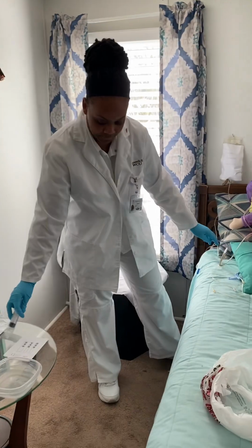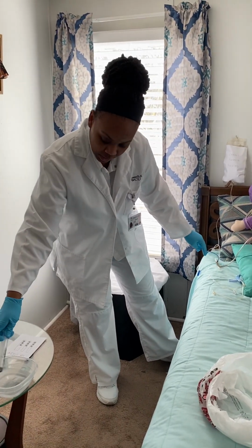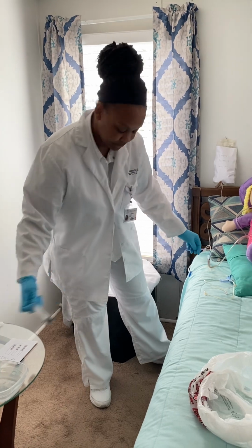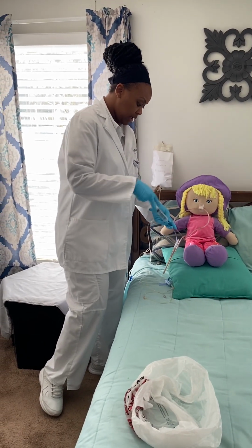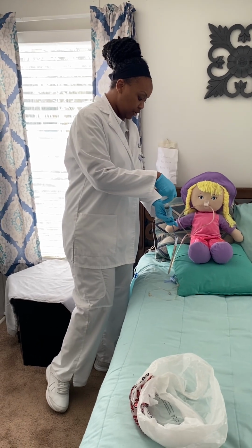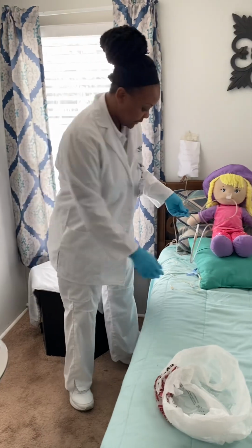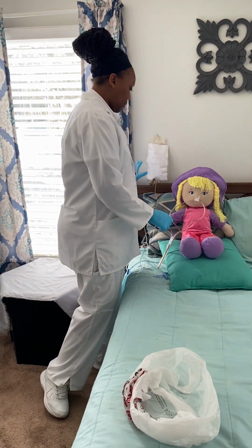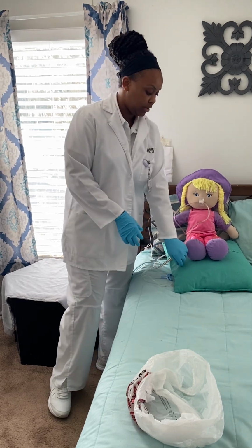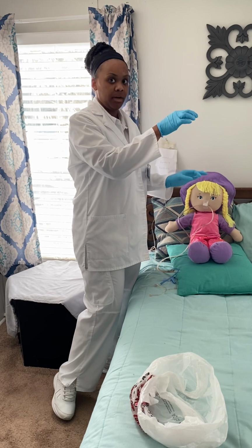So I checked that. And at this point, I would go ahead and pull up 30 mils of water. So I have 30 mils of water pulled up here. And I would flush the tubing. And at this point, I can go ahead and connect my feeding and turn the feeding pump on and allow the feeding to go.